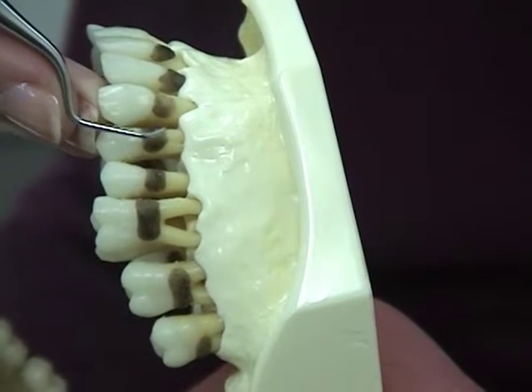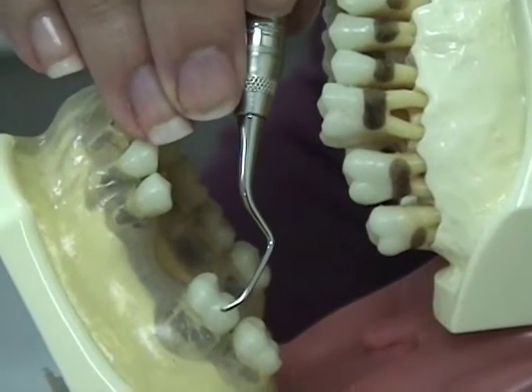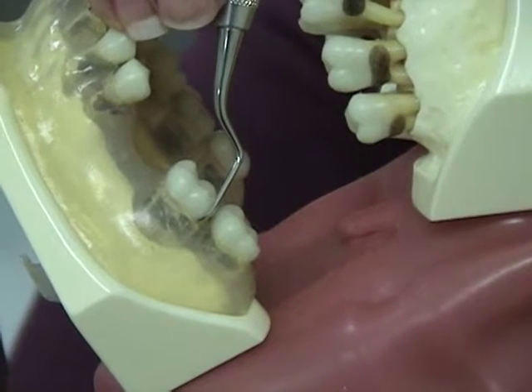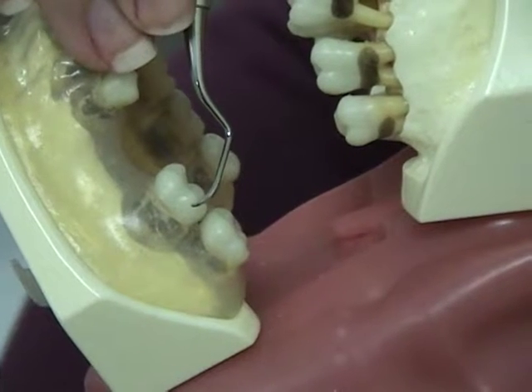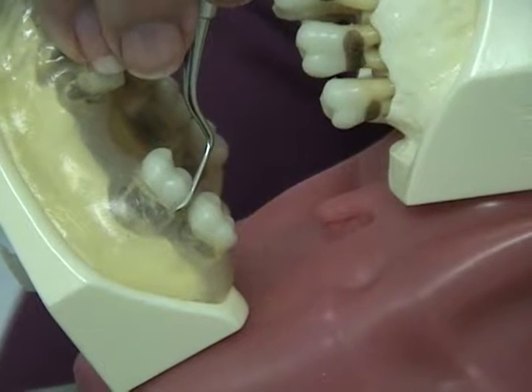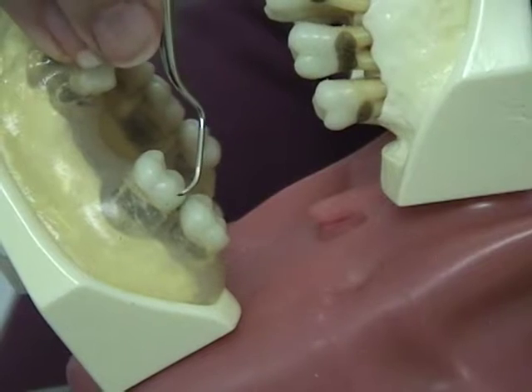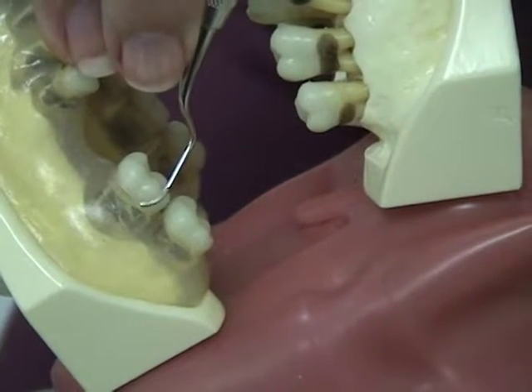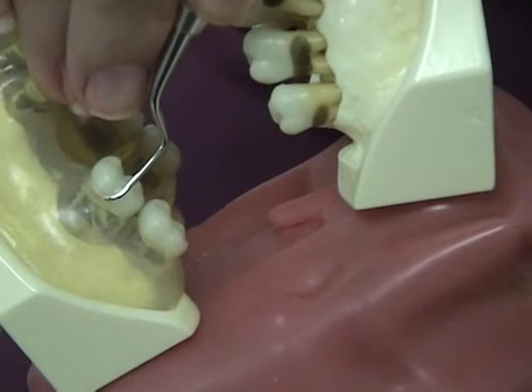Angulation is the relationship between the cutting edge of the instrument and the tooth surface. Only instruments with cutting edges need to be angulated. Since the cutting edge is placed beneath the gingival margin, you can't visually see the angulation, so the terminal shank is used as a visual clue. For insertion, the face-to-tooth angulation should be as close to zero degrees as possible and never greater than 40 degrees — the terminal shank is against the tooth and the fulcrum is lowered. For working angulation, the face-to-tooth angulation should be between 45 and 90 degrees, with the terminal shank parallel to the long axis of the tooth — rise up on the fulcrum finger.